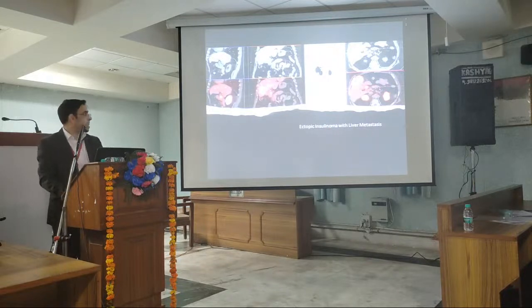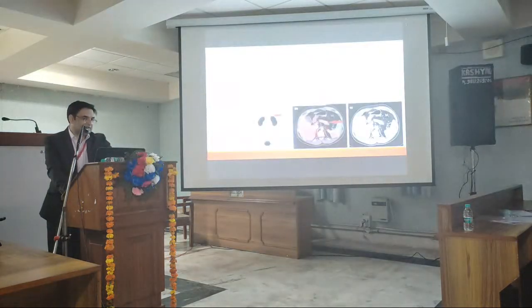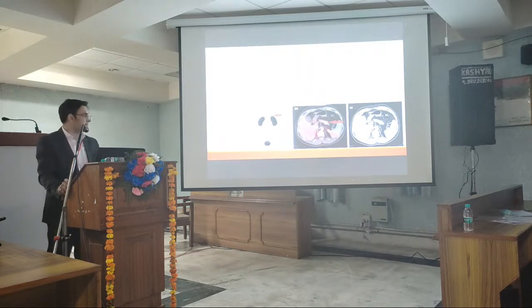This was done with the radionuclide gallium-68 GLP analog exendin scan. So not only in the diagnosis of insulinoma, we can also help the surgeon during the intraoperative period with the localization, with the help of a gamma probe.